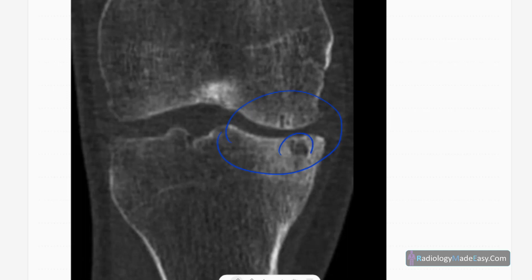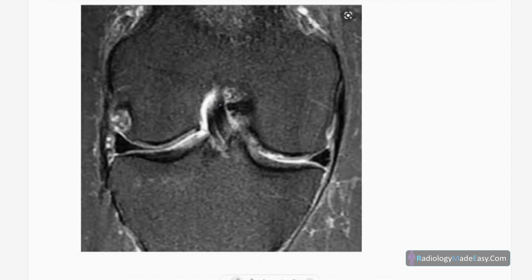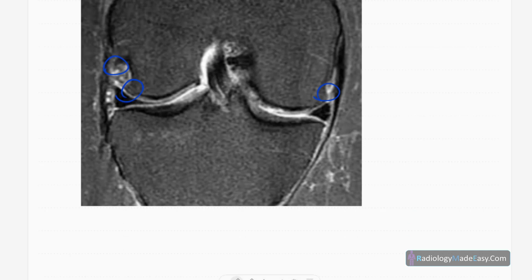Now let's look at the MRIs. These are proton density images showing early disease with osteophyte formation. On the proton density fat suppression image, you can see osteophyte formation and subchondral sclerosis with low signal areas subchondrally. On another proton density fat suppression image, osteophyte formations are seen and the joint space is relatively preserved — mainly osteophyte formation is the dominant finding.